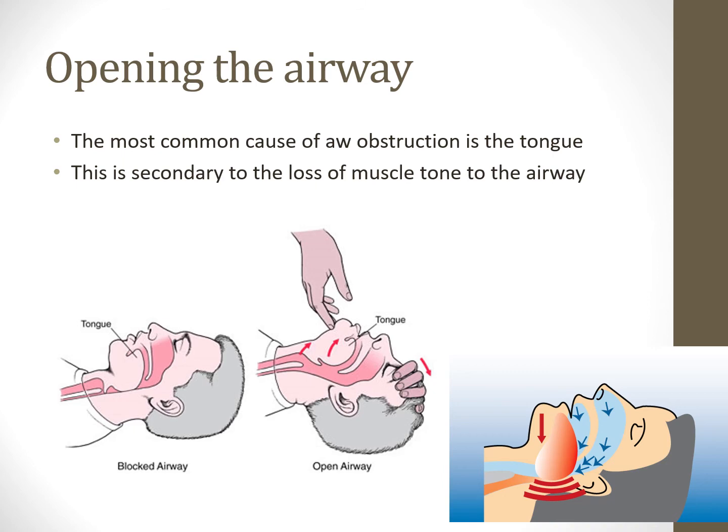And in fact, if you can stabilize an airway and let the patient ventilate on their own before you start jamming tubes and stuff in there, if they're able to breathe on their own and you're just able to take the obstruction of the tongue away from the equation, then you're going to allow for a lot safer intubation overall.